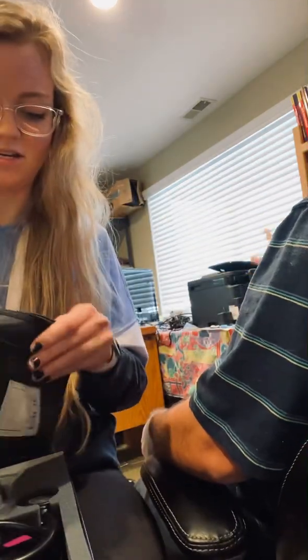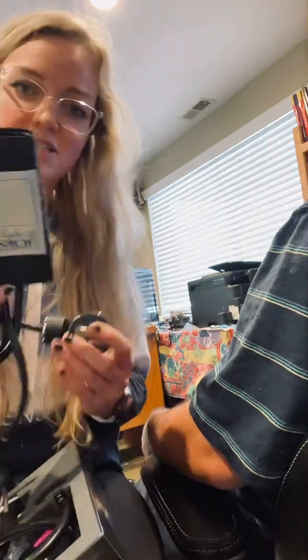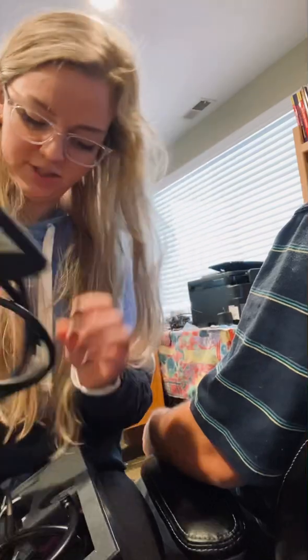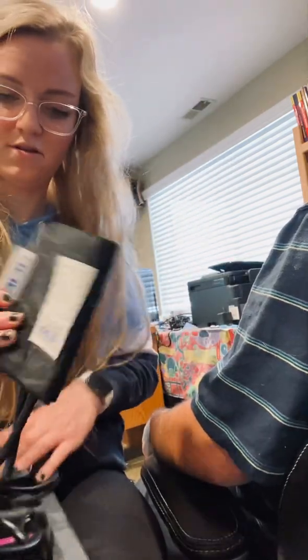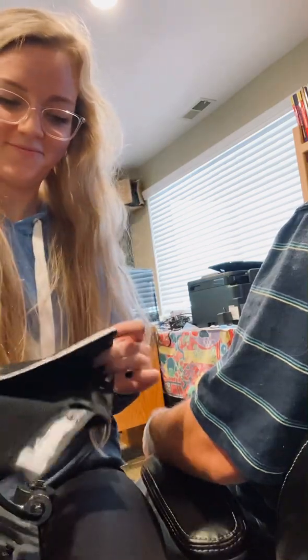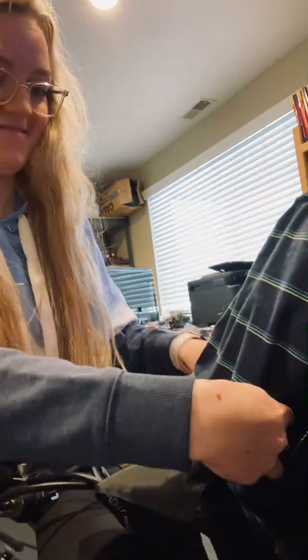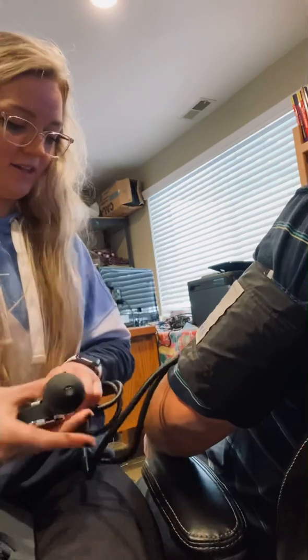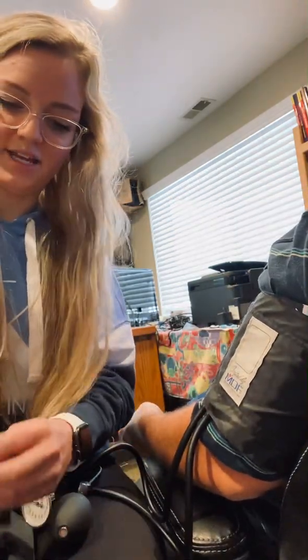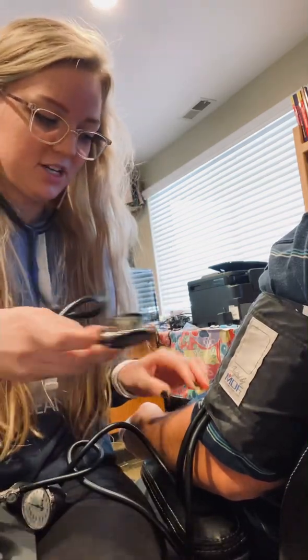So I'm just going to get it set up here. This is the sphygmomanometer — you use this to blow up the cuff and it helps you read the blood pressure. So you just wrap it up like that, and then you just have the person relax their arm. Then I'll take my stethoscope and you just want to listen for the brachial pulse — that's usually on the inner part of the arm.